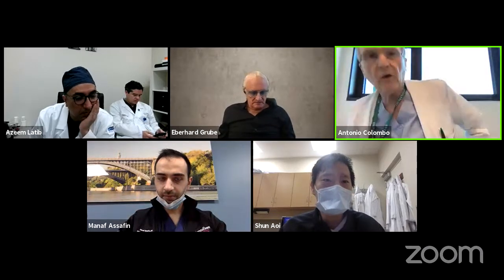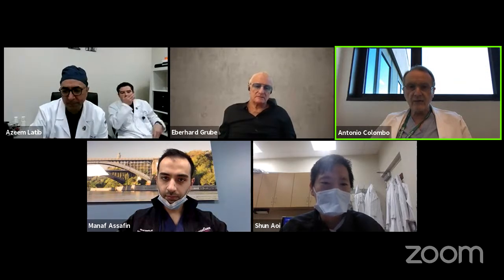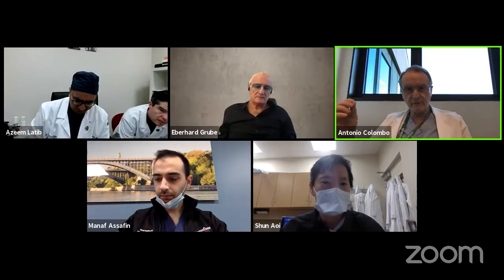Okay, to stent the ostium, first of all, I never use 8mm stents to stent the ostium. Or rarely. Because sometimes if you place an 8mm stent, the stent does not anchor very well and may come out by itself. So maybe for some very short left main, you may have to do that. But other than this situation, I use 12.